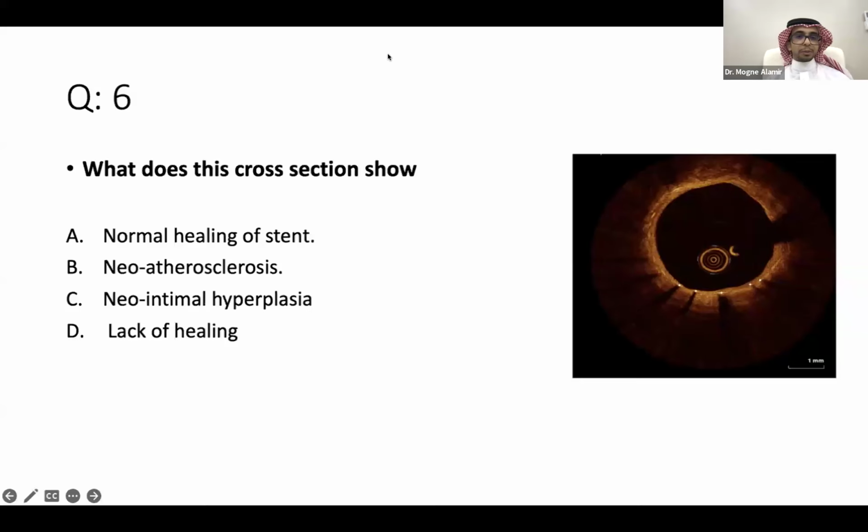What do you think, Dr. Tom? Is it normal healing or is there any stent failure? Yeah, clearly there are stent struts out there. You don't necessarily see struts fully circumferentially. We see stent struts that are certainly evident from about 4 o'clock. Some of them have a mark on them that highlights where they are, which I think is the software actually acknowledging the stent struts.